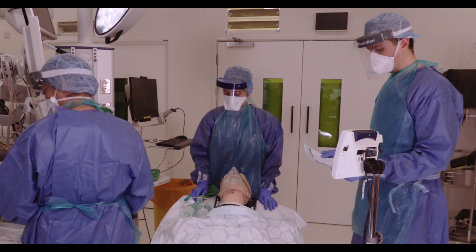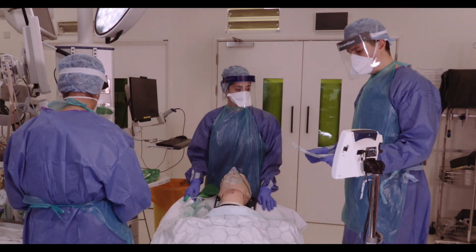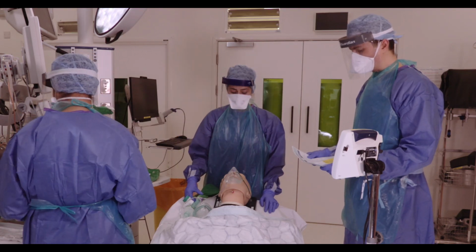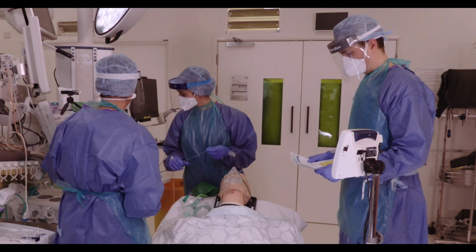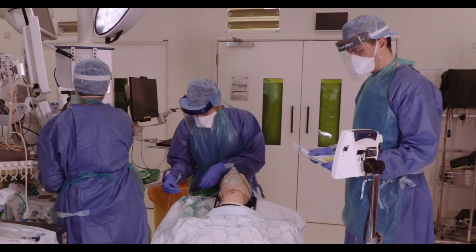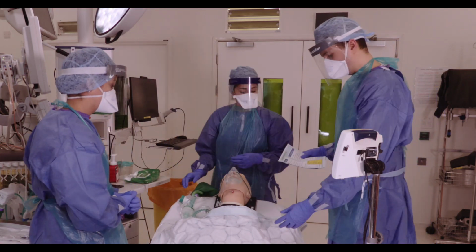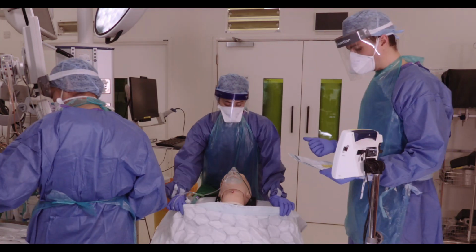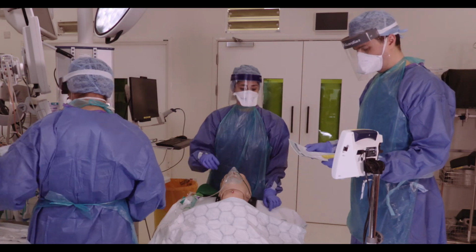Brilliant. Let's check the pre-programmed ventilator settings. I've done that already. Okay. Optimize patient position. Yeah, I'm happy with this position. Apply and check monitoring, including end-tidal CO2. All monitoring is on. You can see it on the screen there. I'll just apply an antiviral filter. Okay, and we've got an Inco pad for dirty airway equipment. Can we ensure adequate IV access with fluid attached and running? Got the two large bore cannulas in, the fluid's running nicely.